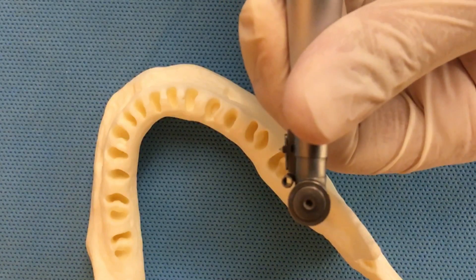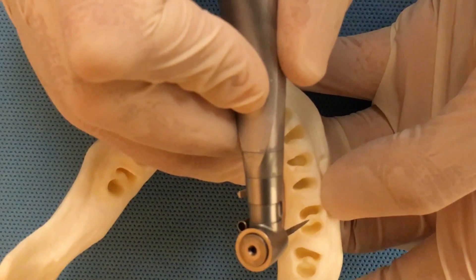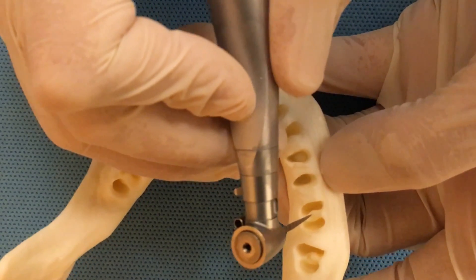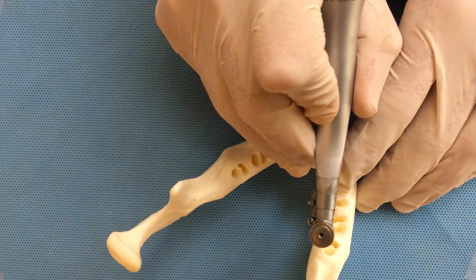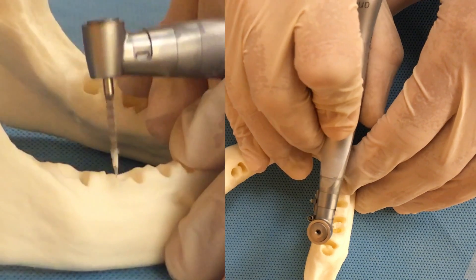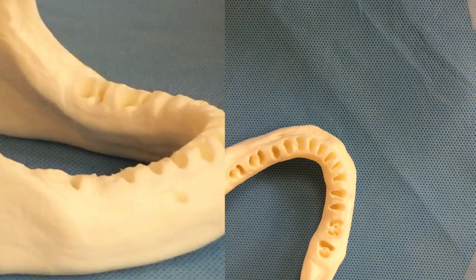Drilling speed: I recommend 1200 to 1500 RPM, so we're going to drill at 1200. We have to make sure we are staying in the center of the two roots. The bone should be stable — if the inter-radicular bone is broken after extraction, you should graft and come back afterwards. We're going to start drilling in the septum and try to keep it as stable as possible with the contra-angle.